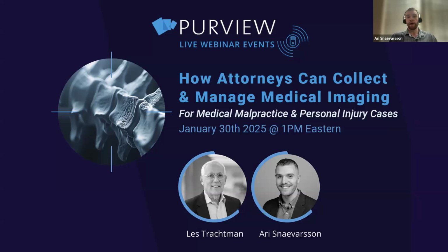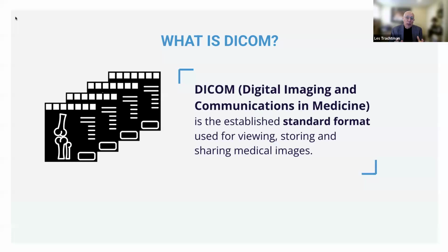Great. And when we talk about medical imaging, the term DICOM often comes up. What exactly is DICOM? Yeah, so all you really have to know is it's a standardized format. You can see on the screen, it's Digital Imaging and Communications in Medicine, nice little acronym that you can either remember or not. But it's the standard format.